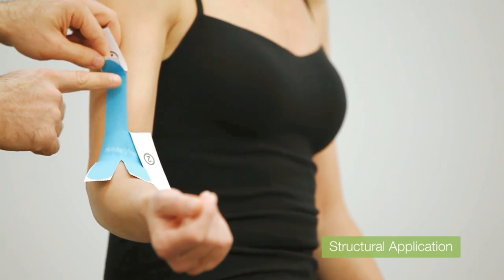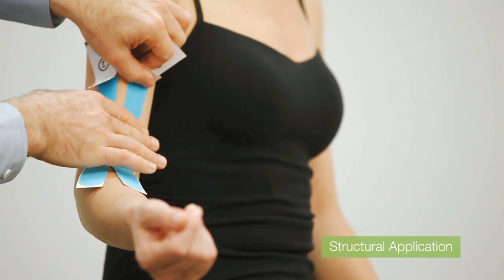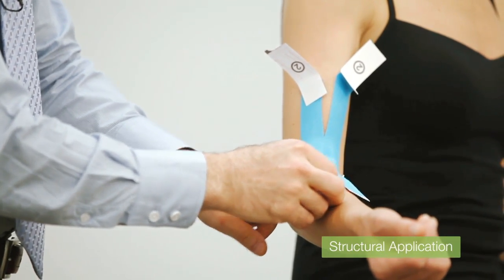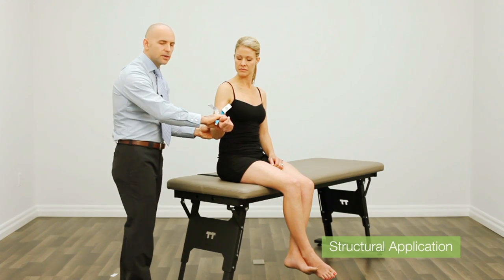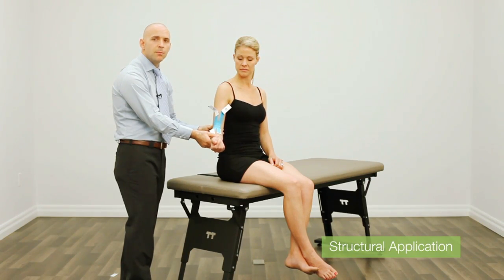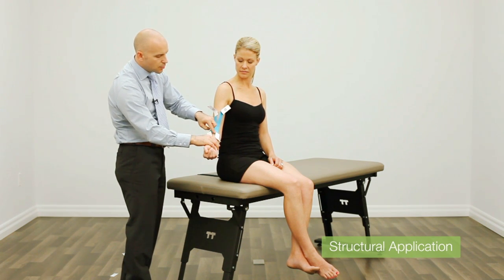With structural applications, never stretch the last inch or so of the tape. Stretch the tape, apply it to the skin, leaving the last portion with no stretch. How much stretch you use is really dependent on your clinical objectives. The shorter you make the tissue structure, the less stretch you need to put on the tape. The less of an angle, the more stretch you would need. You determine the amount of stretch in the tape depending on the clinical objectives you're trying to obtain. Stretch the tape, apply it to the skin, and leave the last portion — about an inch — with no stretch.